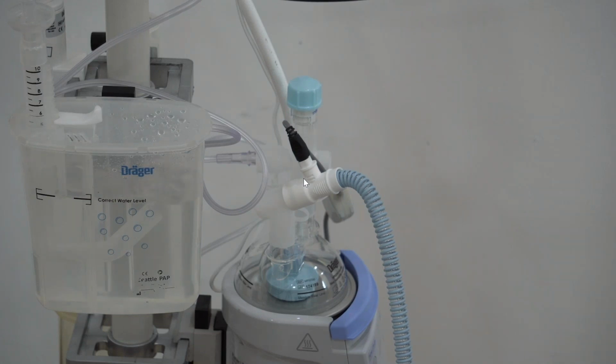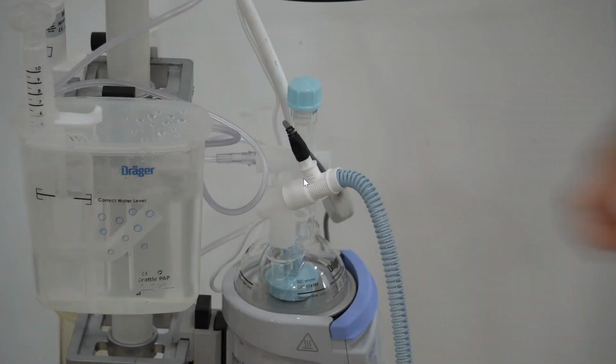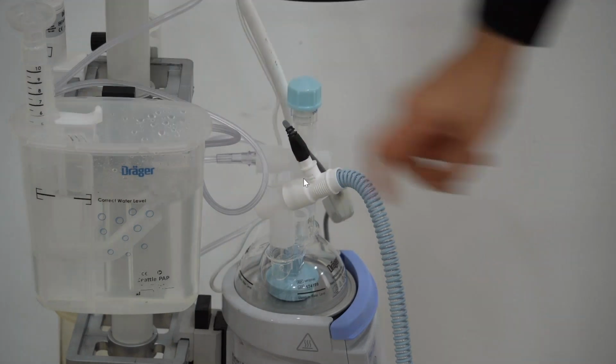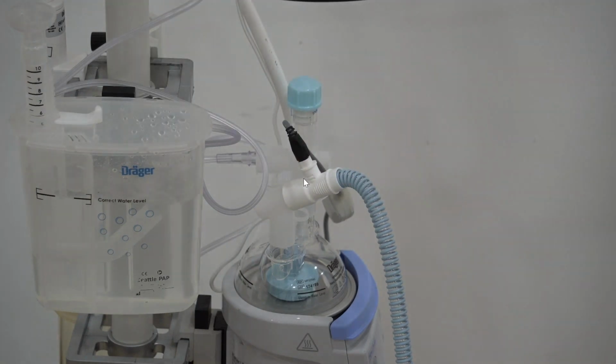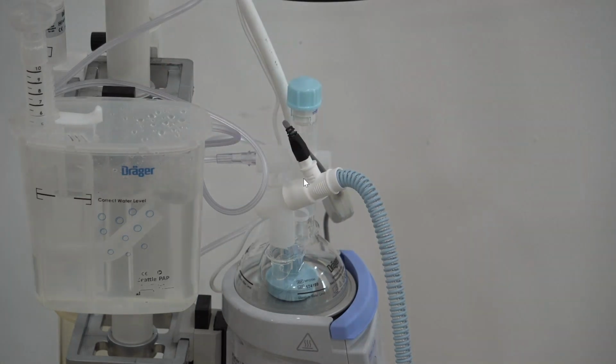But because of the physiological PEEP, the total PEEP might be different. The idea behind it is that the PEEP that we set, the positive end-expiratory pressure, is the parameter that we set. This is the name of the parameter during the CPAP therapy, which is the continuous airway pressure support ventilation. So I think it's just a matter of nomenclature.